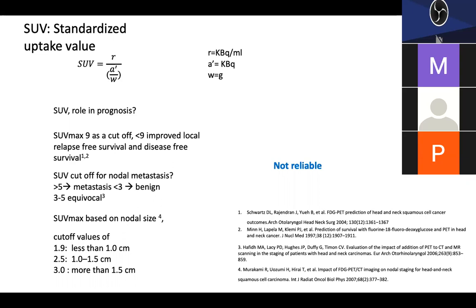Correct. And ma'am, I would like to point out one small thing in terms of post-therapy evaluation. The criteria that we are following now is NI-RADS more or less, but in the Indian setting, I would like to say that it has very low positive predictive value. A lot of the uptake that we see can be very non-specific. If it is NI-RADS 3 and there is a focal uptake, obviously we have to do an FNA. That is what guidelines say. But it is my personal opinion that if the clinical features suffice, we can just observe the patient for 2 months and do another scan, because we have recently seen certain scans where the PET was false positive.